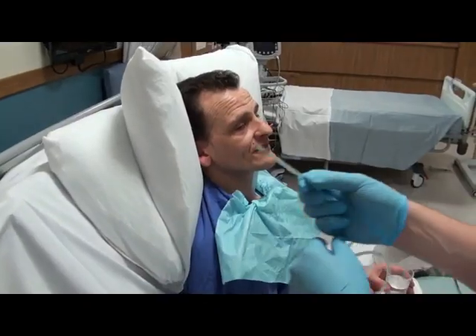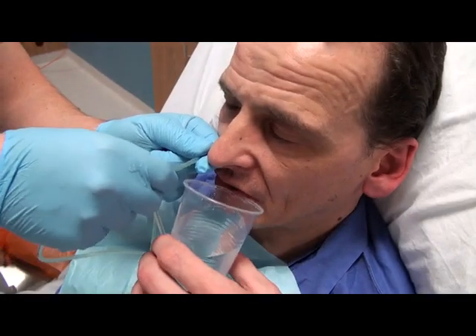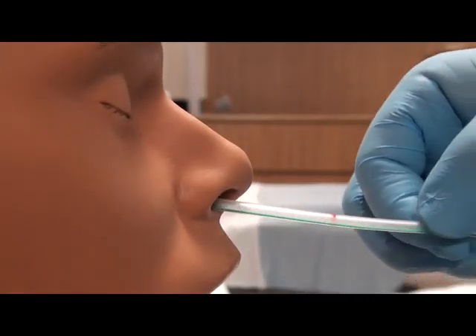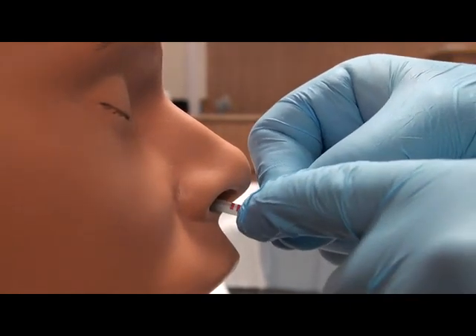Lubricate the distal end of the tube to aid insertion. Insert the tube along the floor of the nasal passage. The patient at this time may need to swallow some water, which will help direct the tube into the oesophagus. Insert the tube in a horizontal plane until the pre-determined marker is reached.